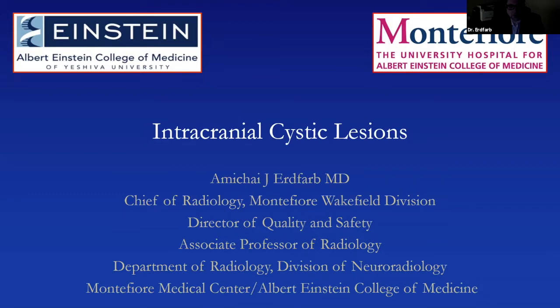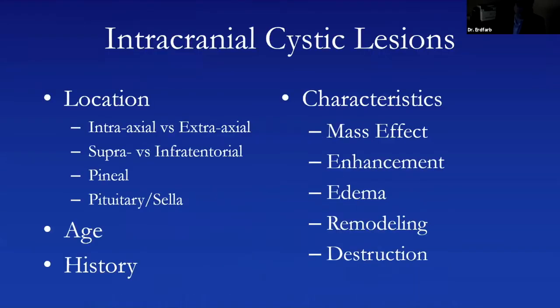We'll talk during the lecture about how some of these slides or single cases are actually a whole lecture in and of themselves. That might be of interest in certain sectors, but we're not going to get into all of it today. But hopefully it'll allow people to have an approach when they see these things on CT and MR.